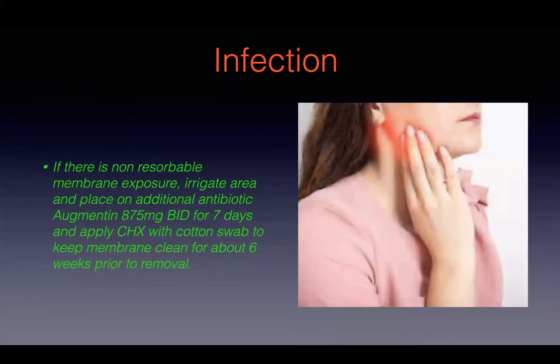I leave it in there typically for about 4 weeks, but sometimes patients cancel their appointments and reschedule and it ends up being 5 or 6 weeks. It's not the end of the world. I mean, the longer it's in there, the better, but then it becomes kind of a pain because now it's completely closed in. Now you have to make an incision and pull that membrane out. For me, that 4 week mark is a nice sweet spot because the tissues haven't completely closed over the membrane. And I just get my explorer and just gently tease it out.